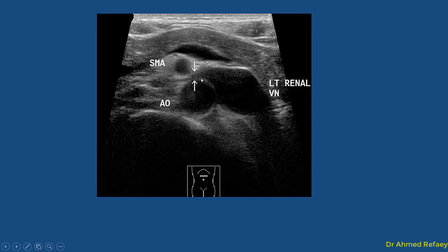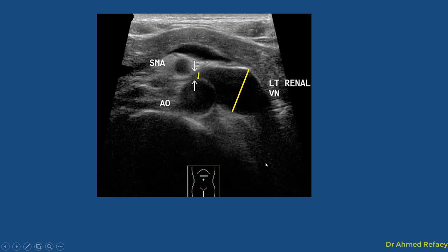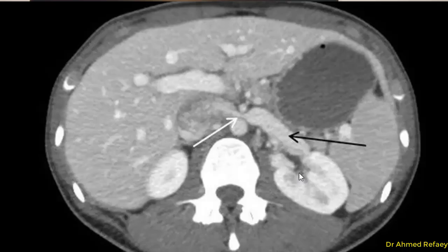As seen in this second example, this is the aorta, this is the superior mesenteric artery, and this is the left renal vein. There is marked dilatation of the left renal vein compared to the markedly compressed segment of the left renal vein between the superior mesenteric artery and the aorta. If we measure the compression ratio — the caliber of the vein proximally divided by the caliber at the area of stenosis — it will of course be more than 2.25.